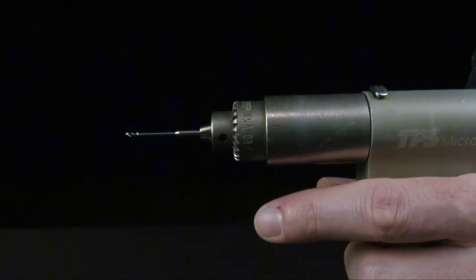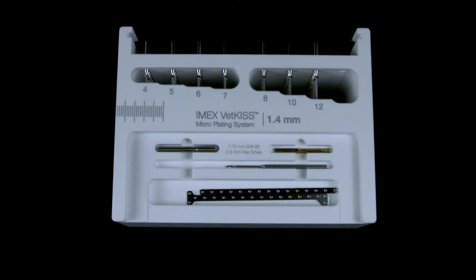Implant caddies are included with each size VetKISS starter set. These autoclaveable containers provide easy access to implants, drill bits, and the corresponding hex driver. Each caddy is laser marked appropriately to assist with implant selection and inventory control. The integrated screw rack helps assure that screws are properly organized according to screw length. Additionally, a scale is provided to double-check actual screw length selection if desired.